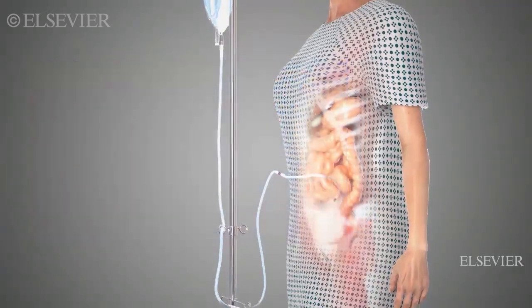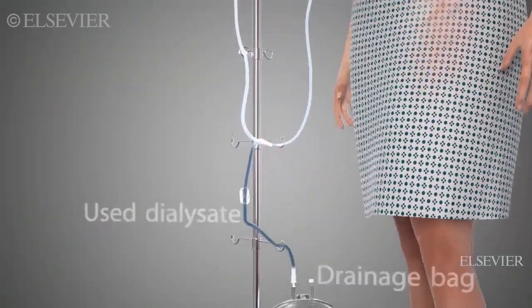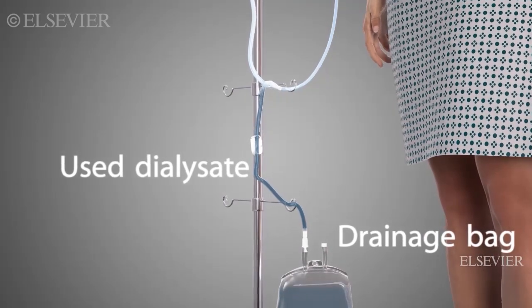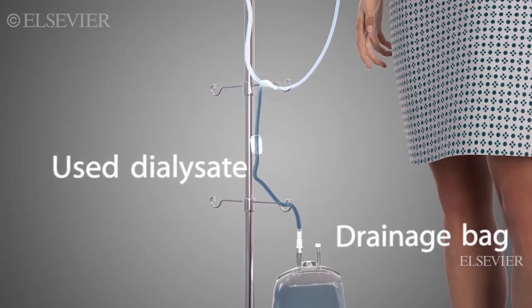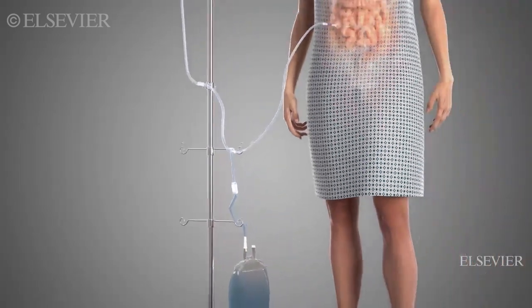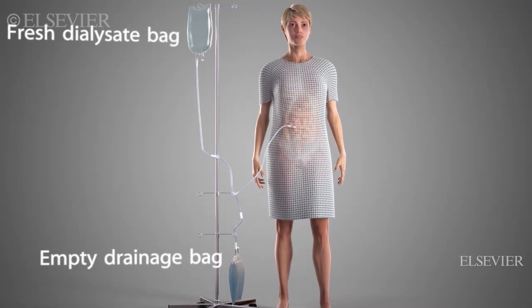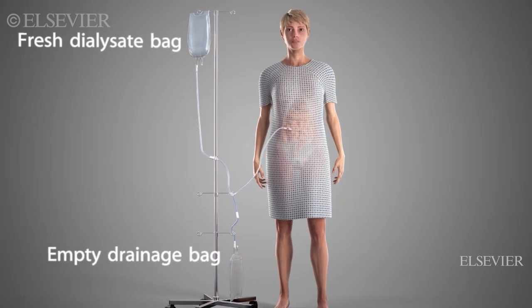In the outflow, or drain phase, the used dialysate flows out of the body by gravity into a drainage bag. The duration, number, and frequency of peritoneal dialysis exchanges vary with the patient's condition.